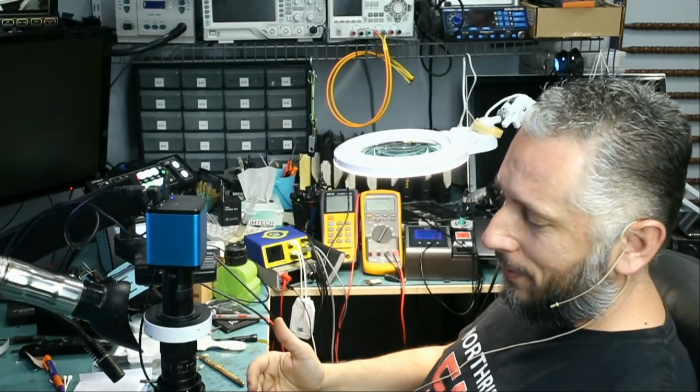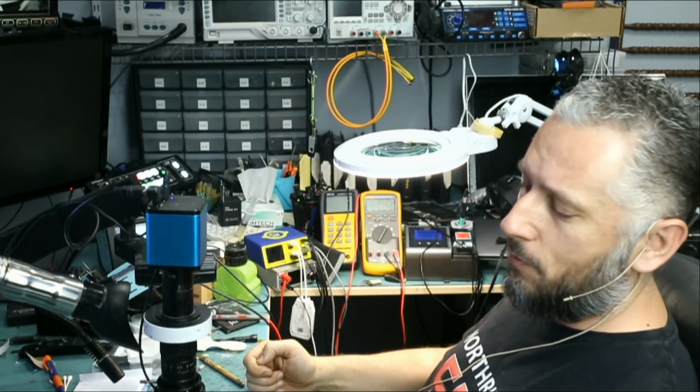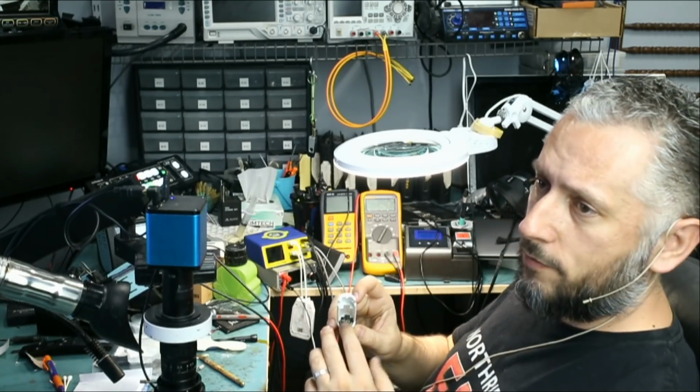Here we have a dental tool. This is the X Smart IQ cordless endodontic motor. It looks something like this. It's already taken apart, and the customer brought this in because 4 pins broke off the board.